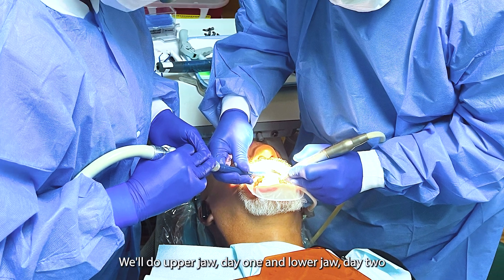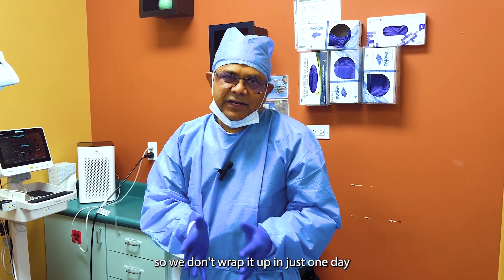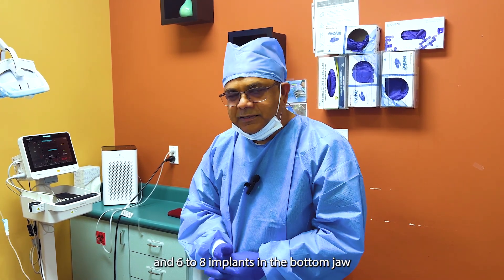We'll do upper jaw day one, lower jaw day two. So we don't wrap it up in just one day and do both jaws. We're going to place six to eight implants in the upper jaw and six to eight implants in the bottom jaw.